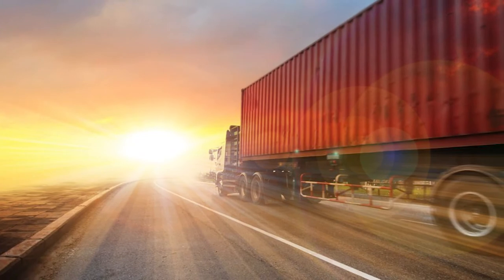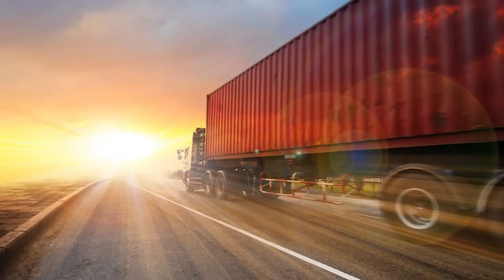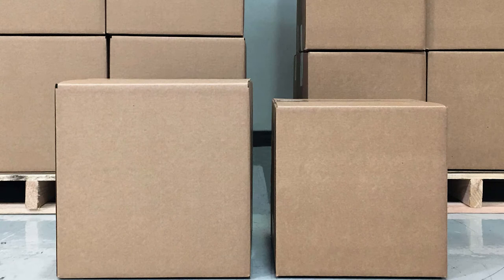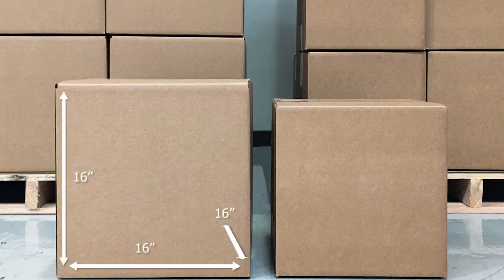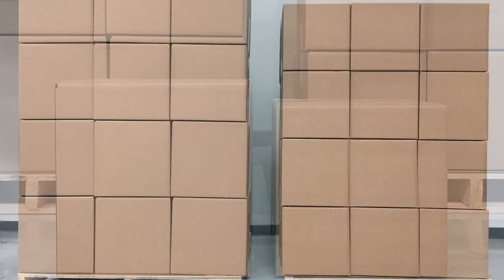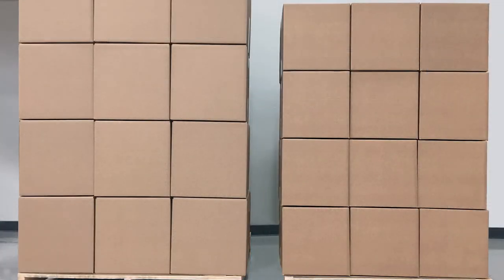By shipping less volume and weight, transportation costs are reduced. In this demonstration, we have packed 7,200 clip dispensers and 7,200 clipless dispensers. Each carton contains 200 dispensers; however, the clip dispenser requires a larger 16 by 16 by 16 carton, while the clipless dispenser uses a smaller 14 by 14 by 14 carton.